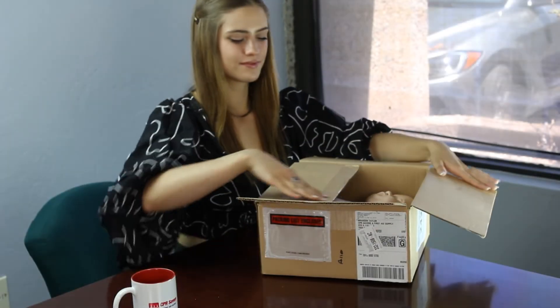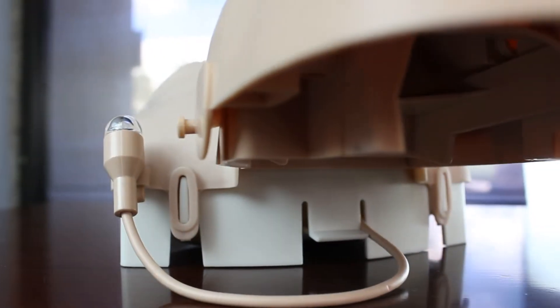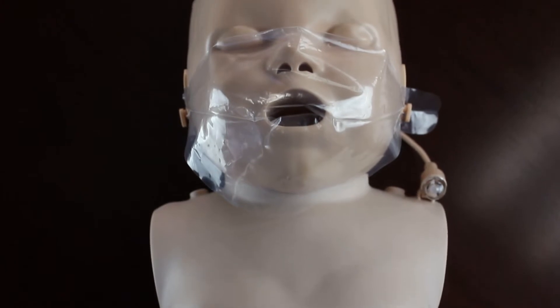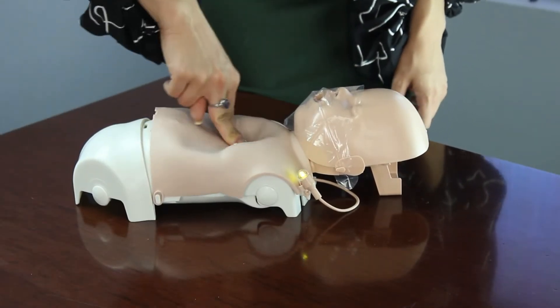An exciting addition to the Ultralight series of products, the Infant Ultralight Mannequin is now available for pre-order. The Infant Ultralight is lightweight, portable, and extremely fast and easy to set up and use.